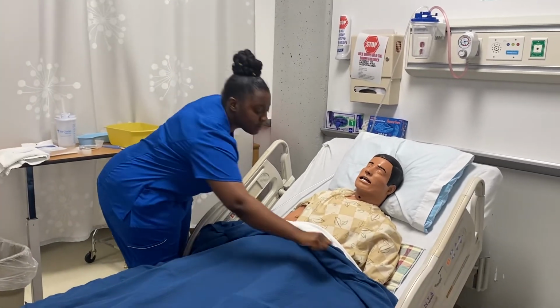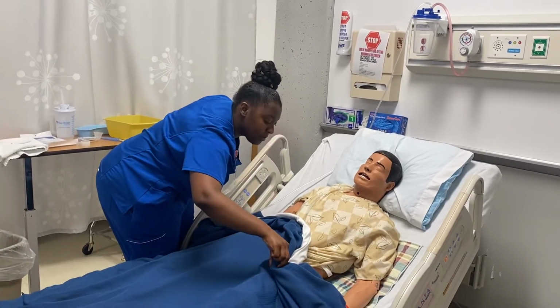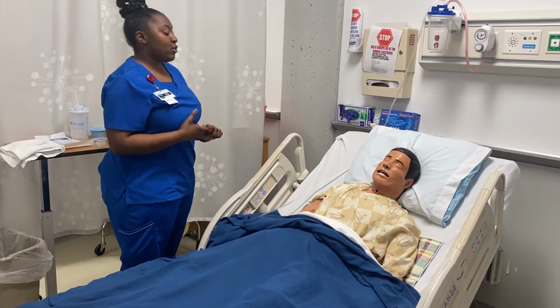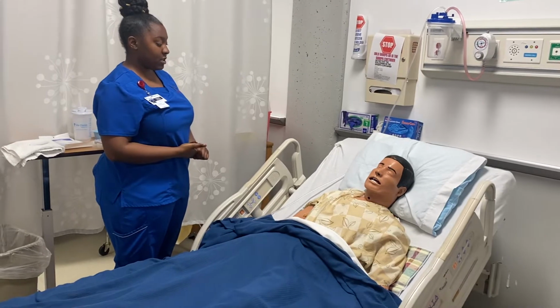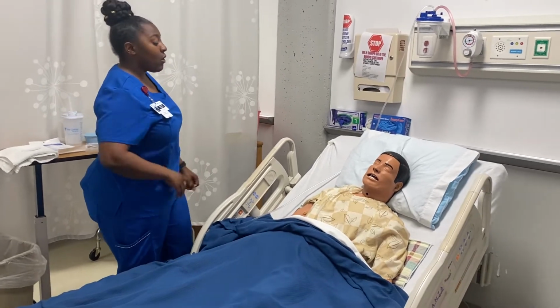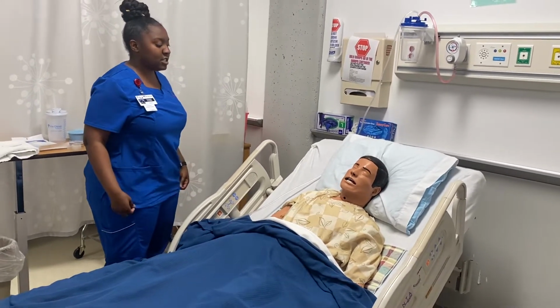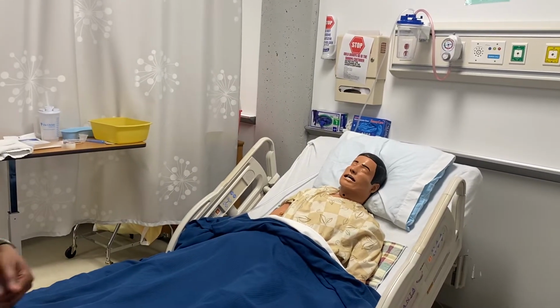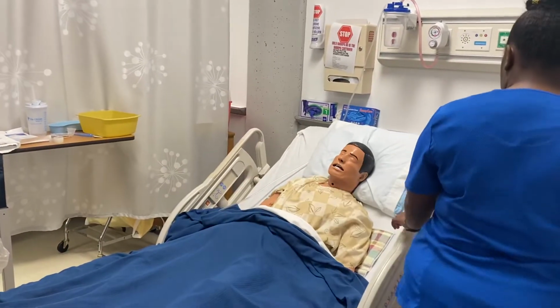Okay, I'm going to check your list. Okay, your name and date of birth. Perfect. Okay, Mr. Newman. So today we have an order for NG tube, if that's okay with you. So we're going to go over a couple of things. I'll ask you some questions and we'll get started. But first, I'm going to lift up your bed to high Fowler's position. So I'm going to get you up.